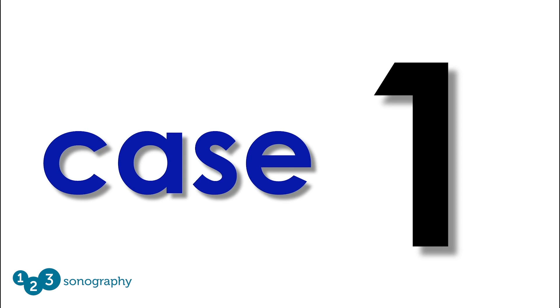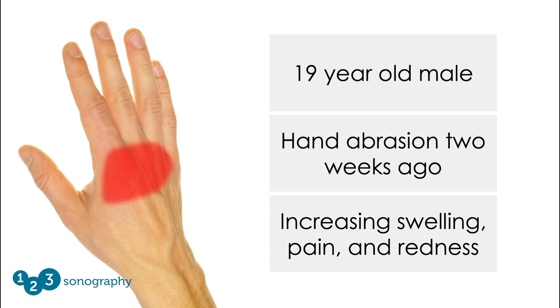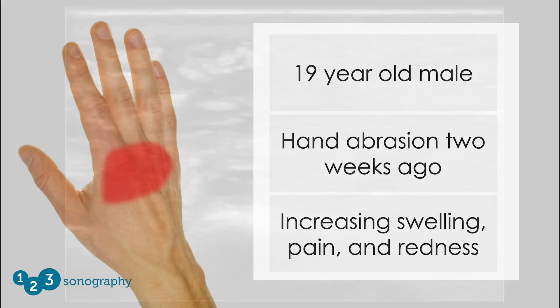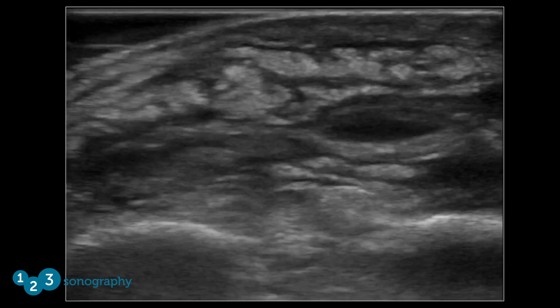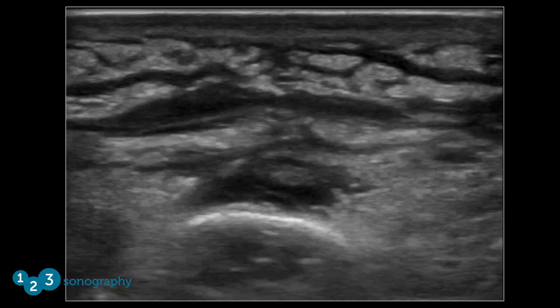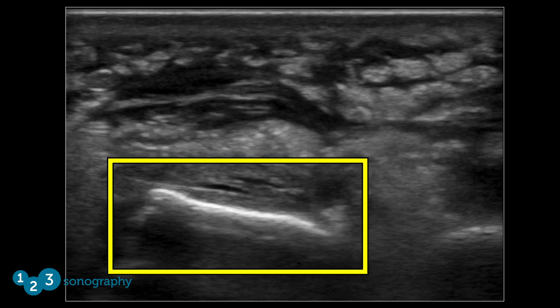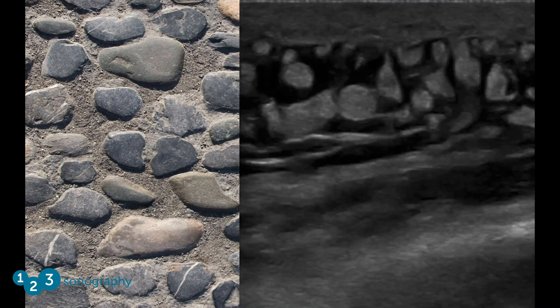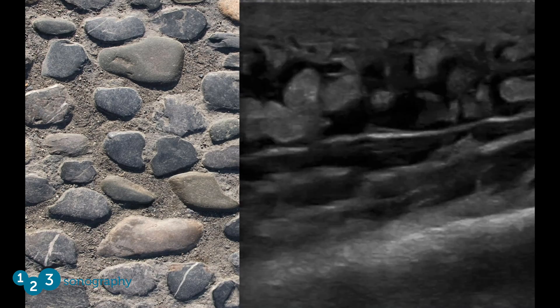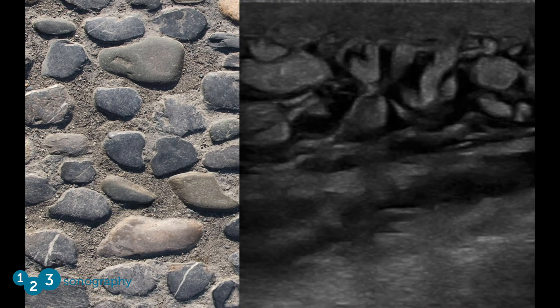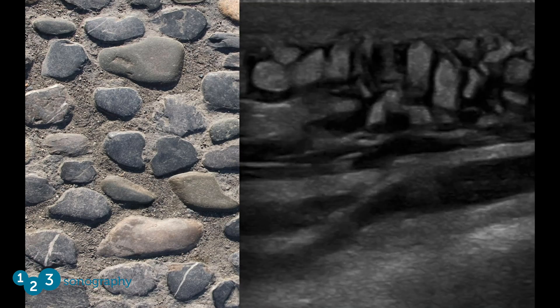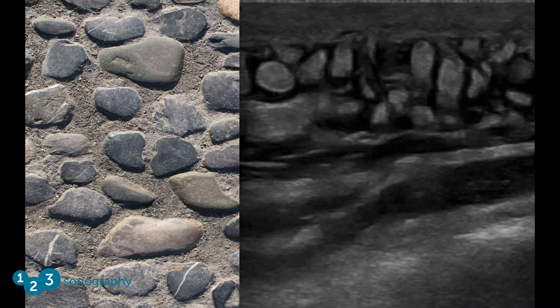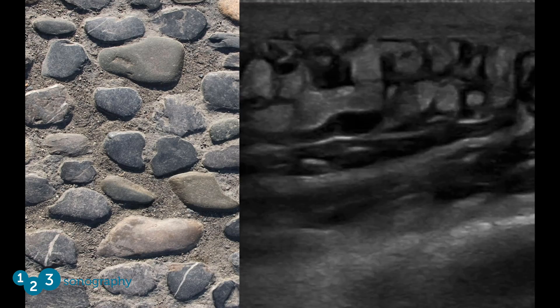Case number one: a 19-year-old male who suffered an abrasion on the dorsum of his hand two weeks prior, now presenting with increasing pain, swelling, and redness at the site. The ultrasound of the area of tenderness shows multiple echogenic structures surrounded by anechoic fluid. At the bottom there is a hyperechoic structure — the metacarpal. The pathologic pattern seen in the soft tissue is referred to as cobblestoning. The stones are areas of subcutaneous fat surrounded by serous fluid, seen in conditions where extravasated fluid collects in the soft tissue. In this case, the fluid is caused by inflammation from cellulitis.